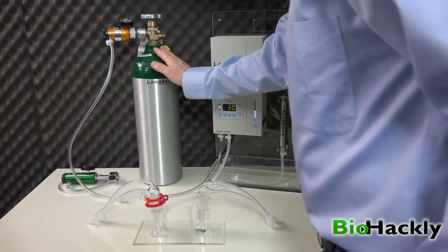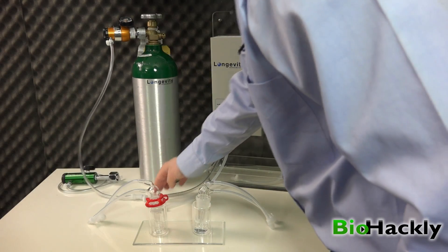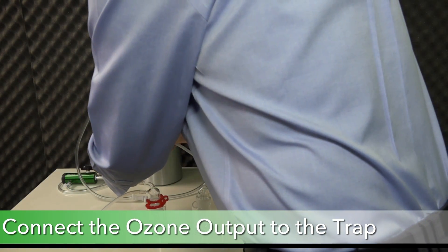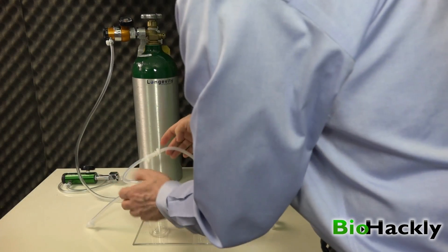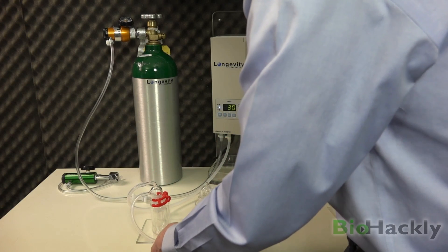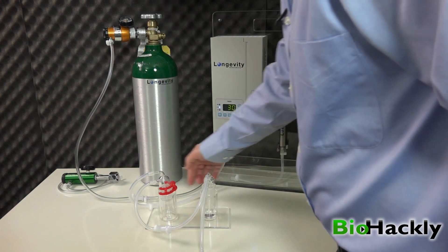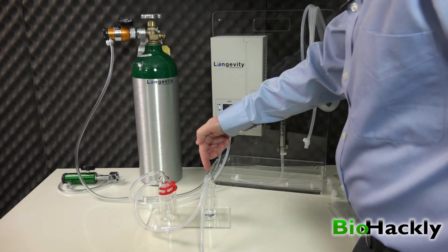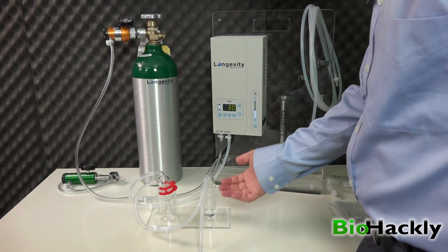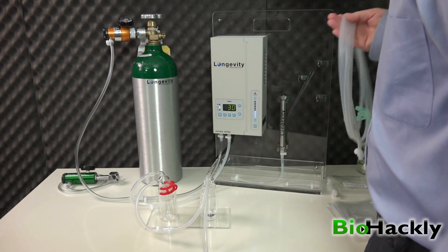Let's hook up the machine. I'm going to take the oxygen output — the clear line — and run it into the clear input line on the ozone generator. It's a quick connect that just slips together with a snug fit. The ozone output, which is the silicone line, runs into the top of the trap. It will only go one way since the bottom is a male adapter. Then we take the bottom of the trap and plug it into the top of the bubbler, which also only connects one way. The bubbler will humidify the ozone — instead of using a spray bottle, the ozone comes through already moisturized.